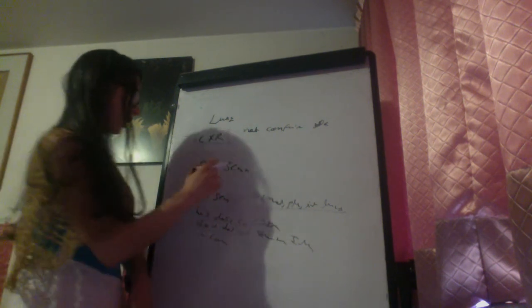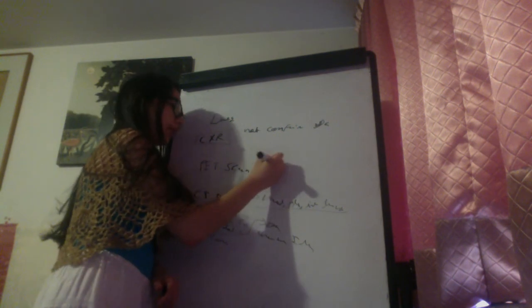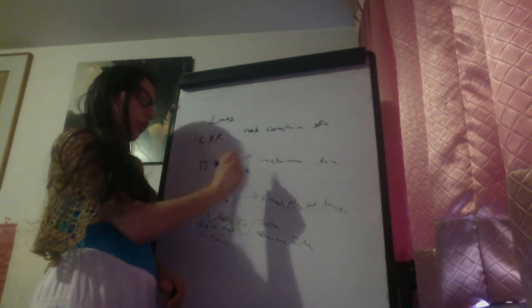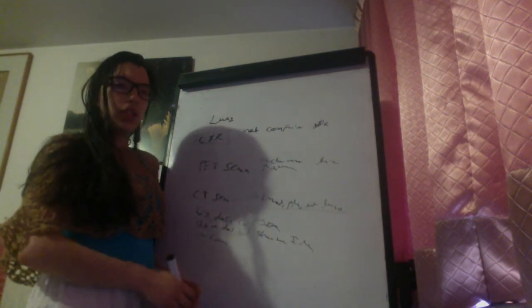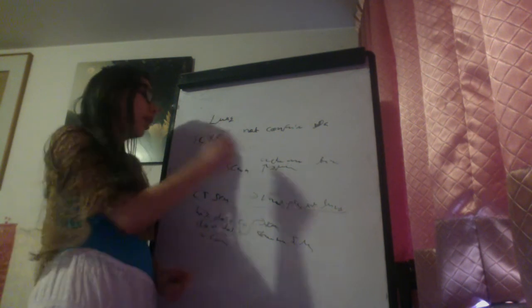And the PET scan, this is used for metabolically active tissue in which there is increased, for example, glucose uptake. For example, in a lung cancer, there is increased glucose uptake, and so it is metabolically active, and that will be caught in the PET scan.